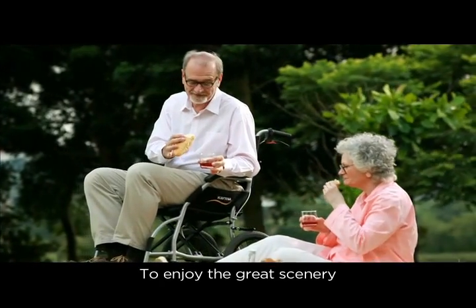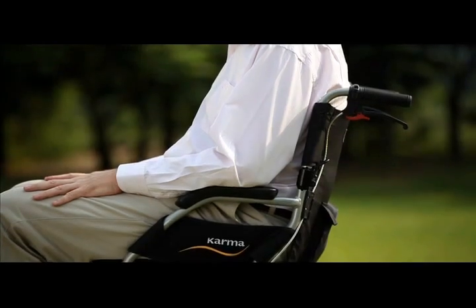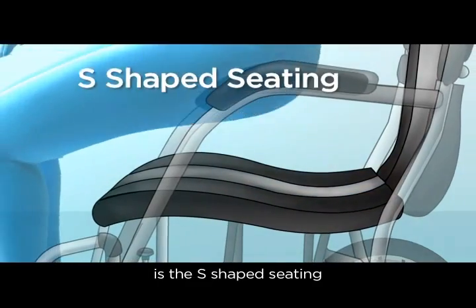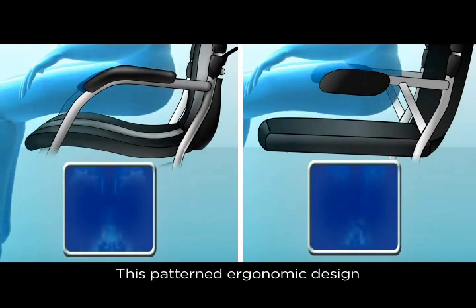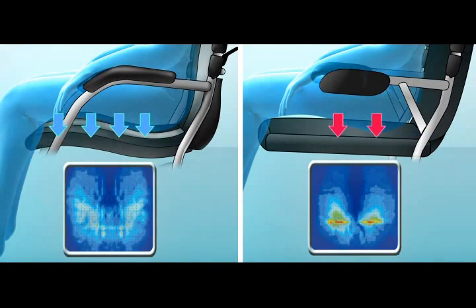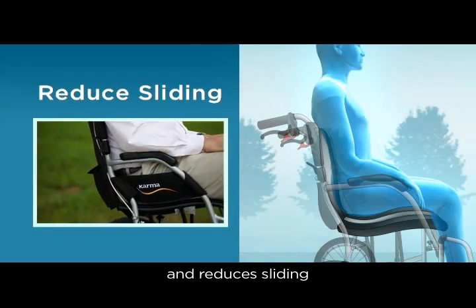To enjoy the great scenery, comfortable seating is essential. The most unique feature of Ergolite is the S-shaped seating. This patterned ergonomic design can reduce sitting pressure. It also provides solid support and reduces sliding.